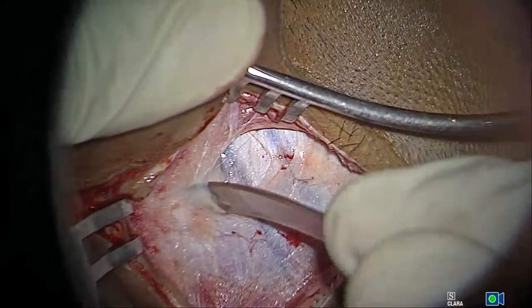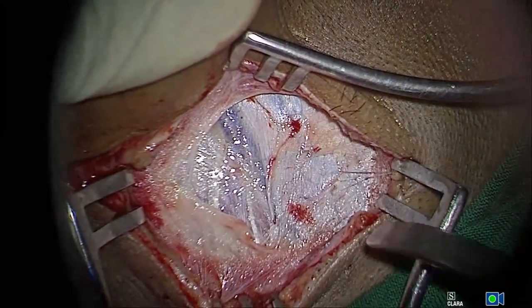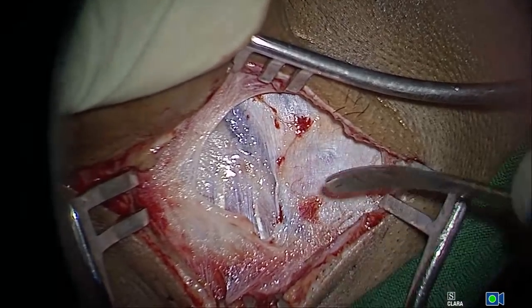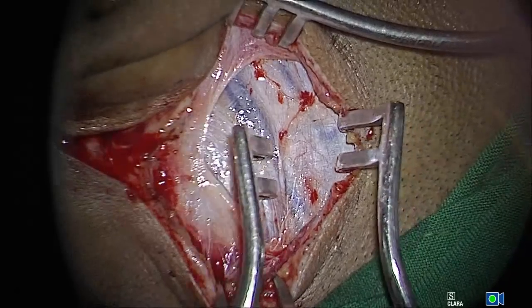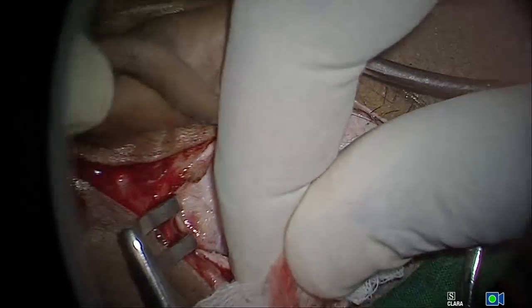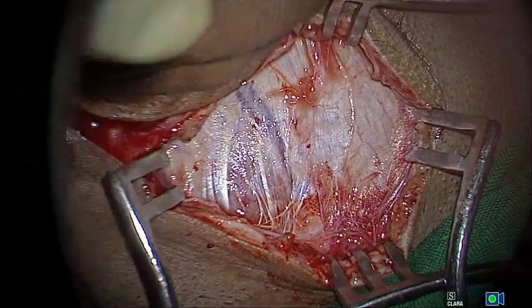Very important for me, I don't like a thick graft. This is something I don't like. I like to have a very thin layer of fascia. For that, I'm a little fanatic about the quality of the graft. So I'm just going to expose a little more so that I get a better area of the fascia. You can see that as we go up, the fascia is thinner.